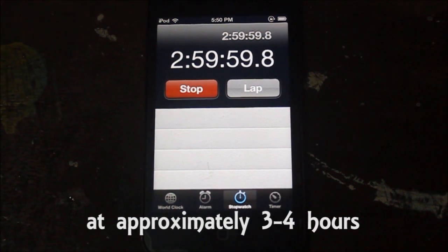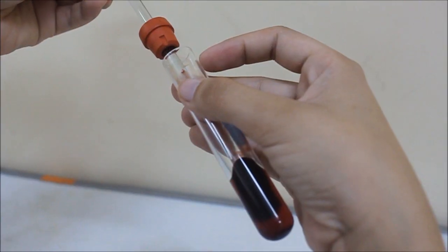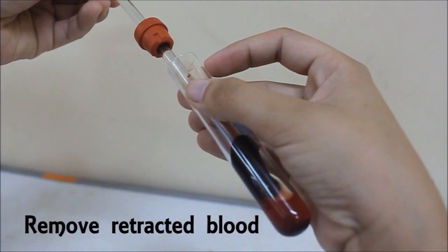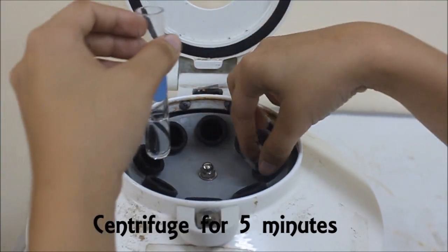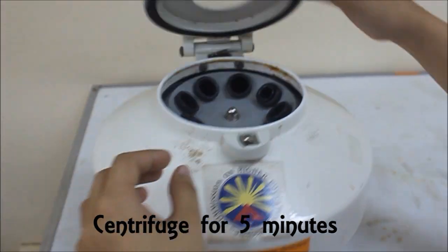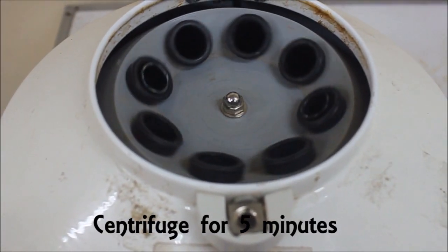Once the blood has retracted or the blood clings to the stirring rod, remove the cork containing the stirring rod and the retracted blood. Centrifuge the remaining serum in the tube so as to eliminate the remaining cells.